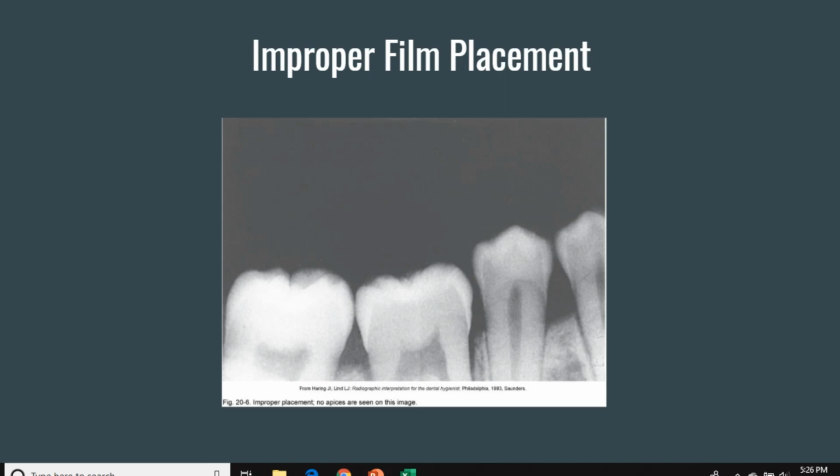So this film was not positioned correctly in the patient's mouth to cover that full apical region. So if we are looking for something like an abscess that appears at the bottom of the apex of the tooth, typically, we're not going to see it. So to correct this, make sure that that film is placed so that no more than 1/8 of an inch of the film extends beyond that occlusal surface.